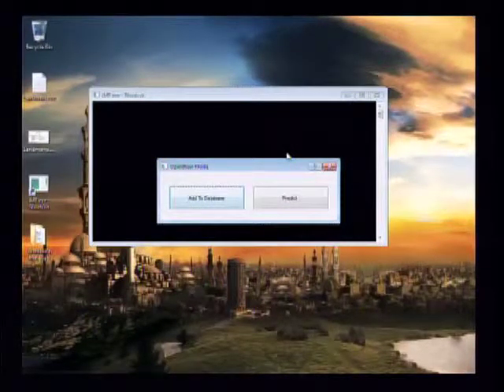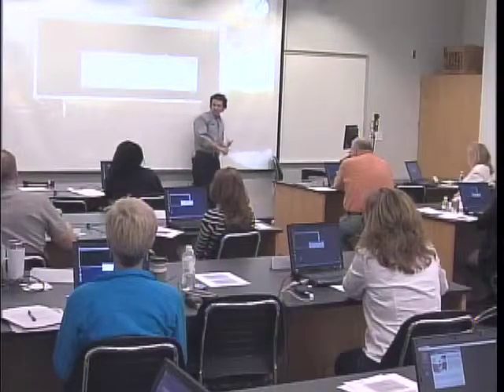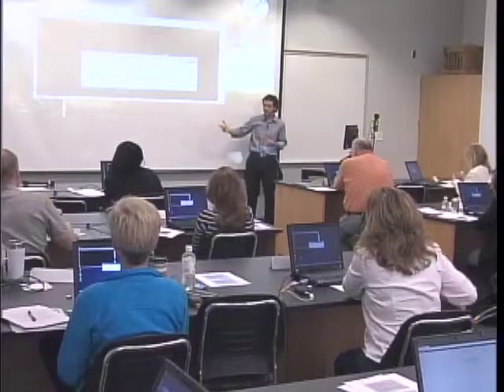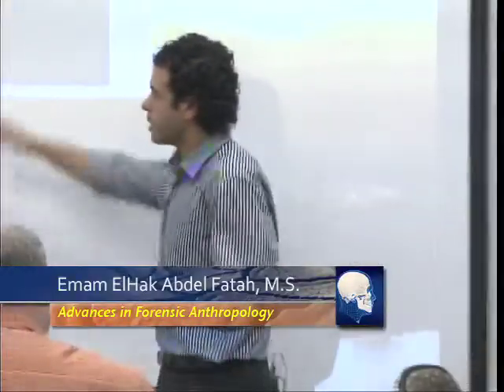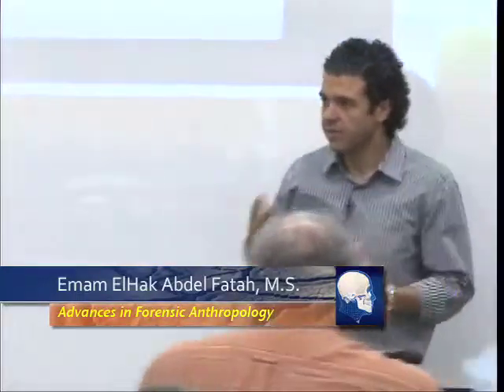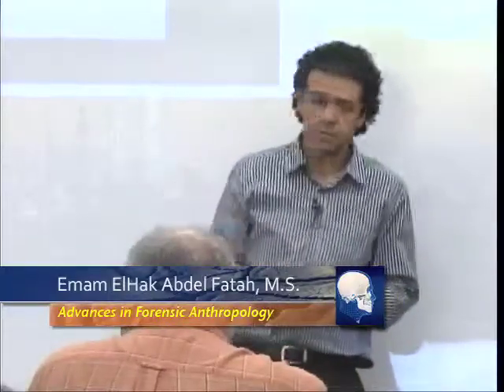Okay, so these are the two modes that we can run in. The first mode, add to database, basically in this mode, you will need the CT data, because then we will acquire soft tissue thicknesses along with bone thicknesses and some measurements. And in the prediction mode, you don't need the CT, all you need is just the IV file or STL file for the surface model that you segmented before.